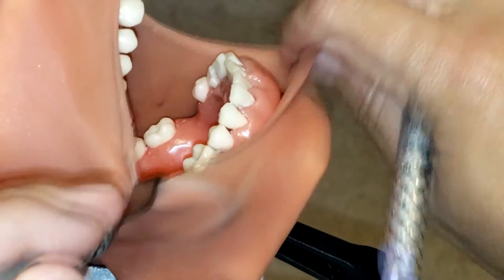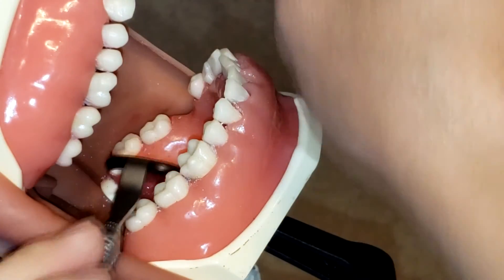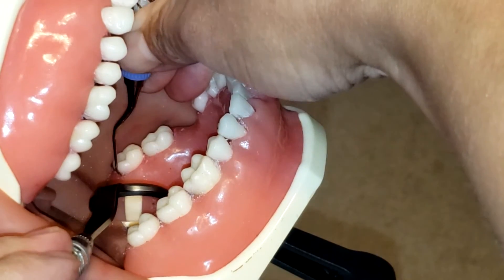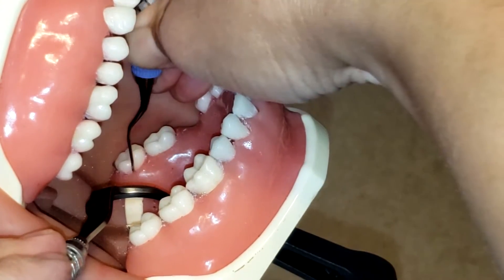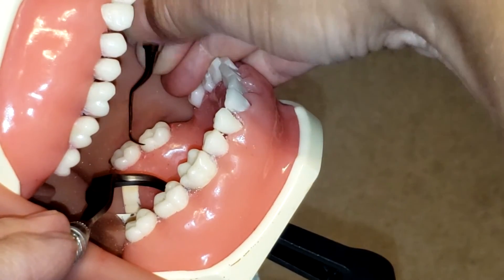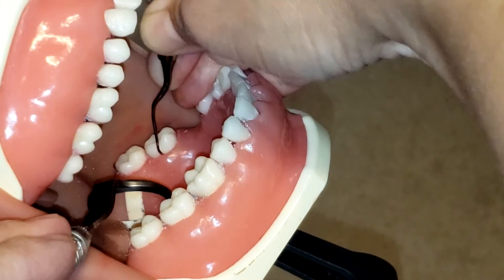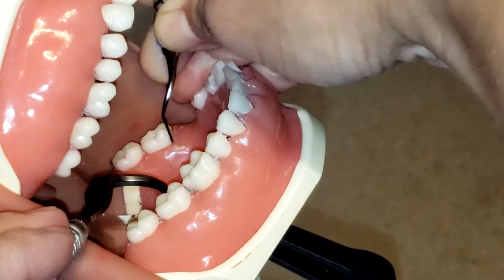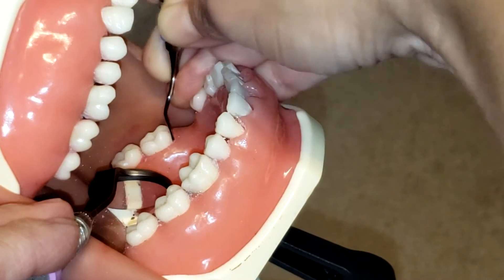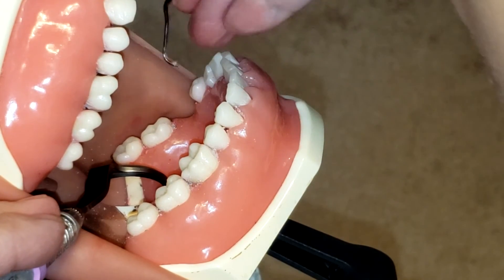Now I'm going to show you how to use this instrument on the lower left molars. Again, you start at the distal line angle and go all the way in proximally. Remember, the col is very important when you go into that interproximal space, because that is where you mostly tend to leave calculus behind. You can see how I'm creating that 70 to 80 degree angulation — tilting the instrument and rocking on my fulcrum — that is what's needed to remove the calculus, especially from that col.